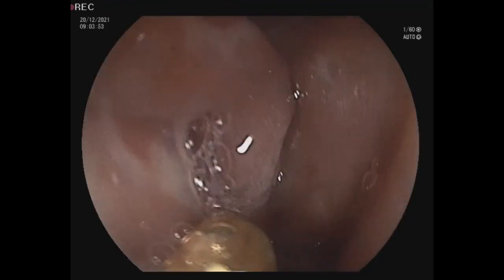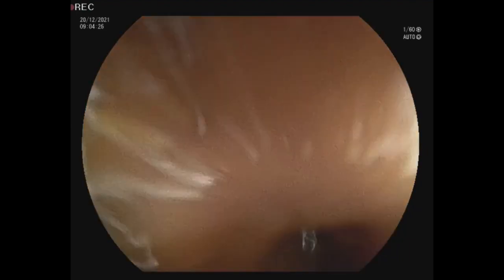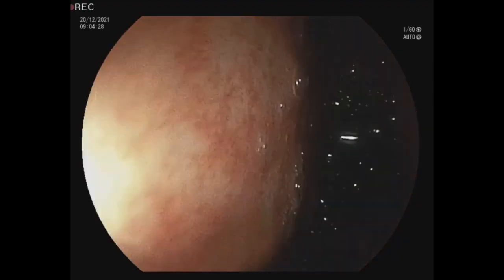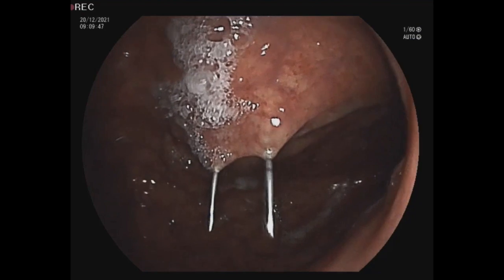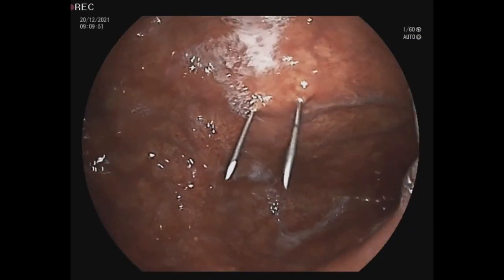First we want to check if there is no other problem in upper GI endoscopy, up to the second part of the duodenum, and then we will show you how we use the set for the gastrostomy procedure.